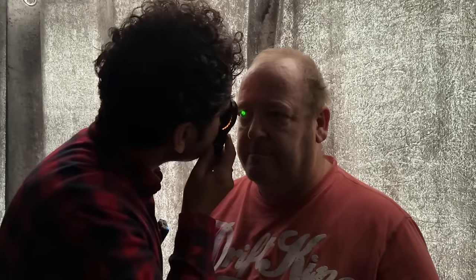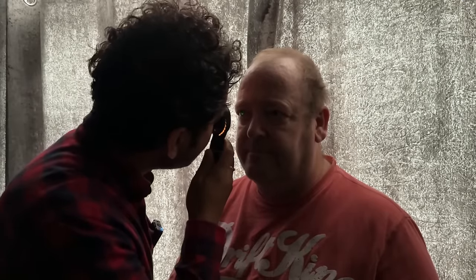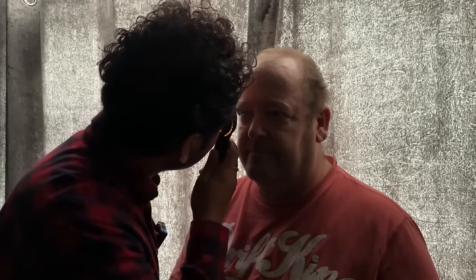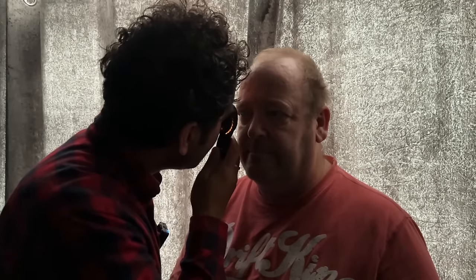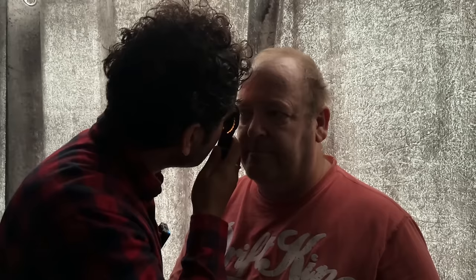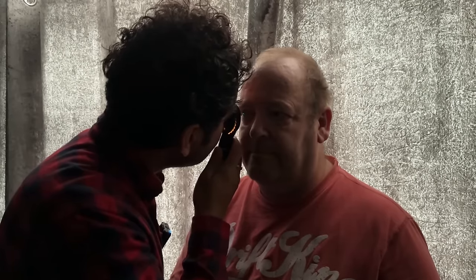And also we can use the small aperture with the green light. Just looking into the light now. This is also good for showing up any potential haemorrhages, which will also show up as black. That's the right eye completed. Thank you.